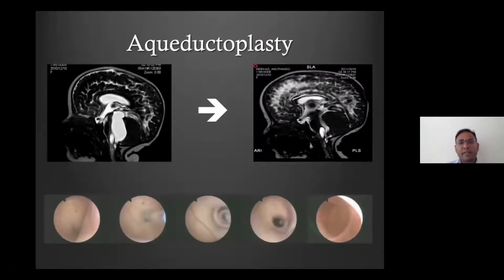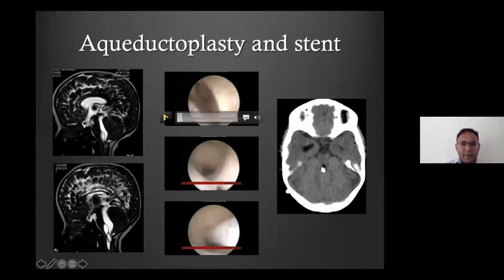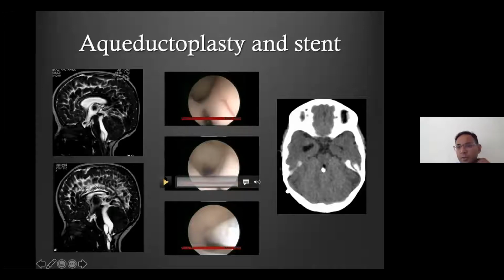The treatment modality here, the aqueductoplasty, and we've treated more and more of these patients now. And right at the beginning, we sort of opened the aqueduct endoscopically, didn't place a stent, but now we routinely supratentorially place an anchored stent. And these videos will show how we do that. So endoscopically, supratentorially, you'll see we found that the aqueduct occluded. But with the arachnoid cyst, it's a little different. Obviously, you try and fenestrate the cyst, but the principle is still the same.